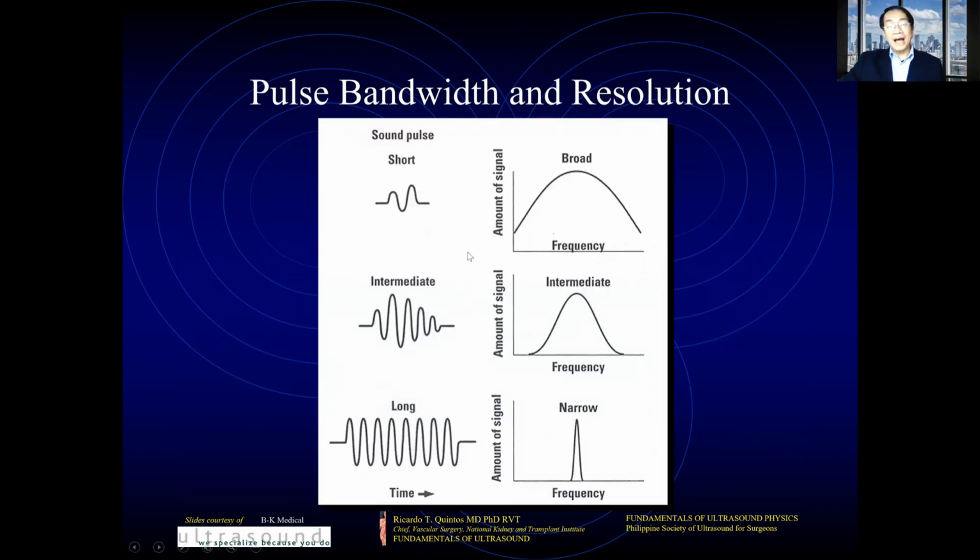So here is just a diagram of the pulse bandwidth and resolution. And resolution is affected by the pulse bandwidth. We talked about the pulse echo principle, and we talked about pulse wave versus continuous wave. So the pulse wave will have an effect on your resolution.